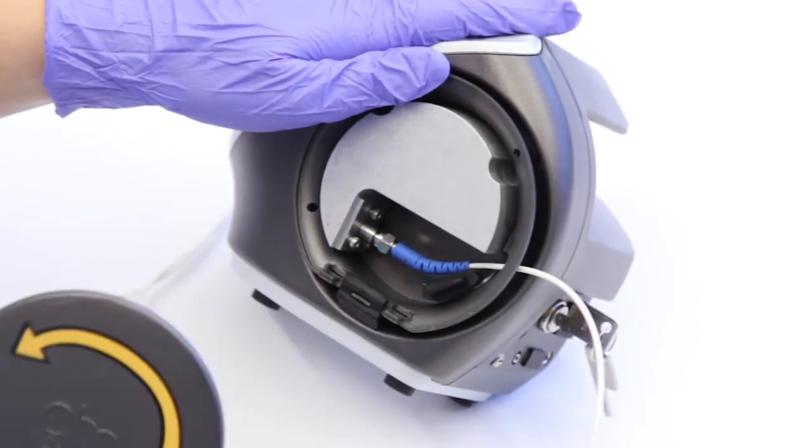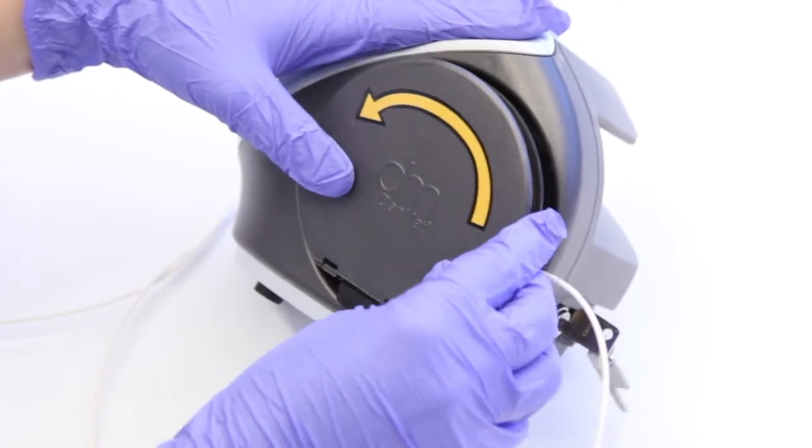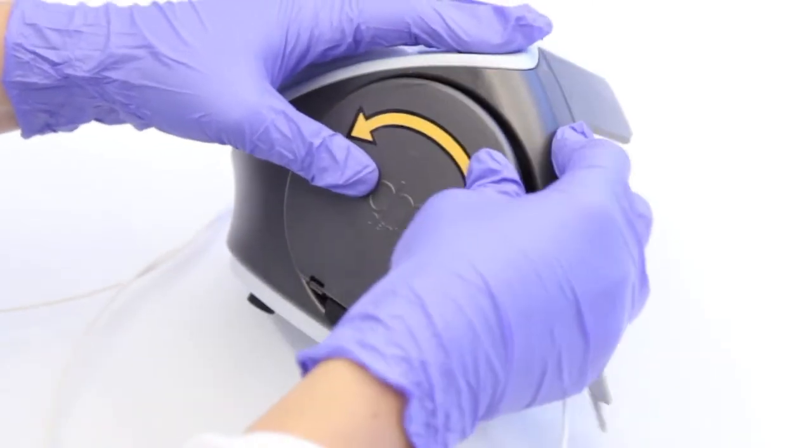Snap the wind cover back into place by placing the lower plastic tabs into their corresponding slots. Then, press the entire piece into place.